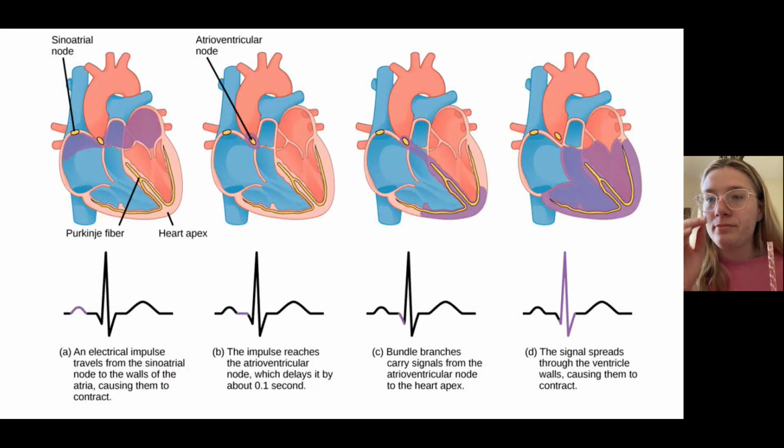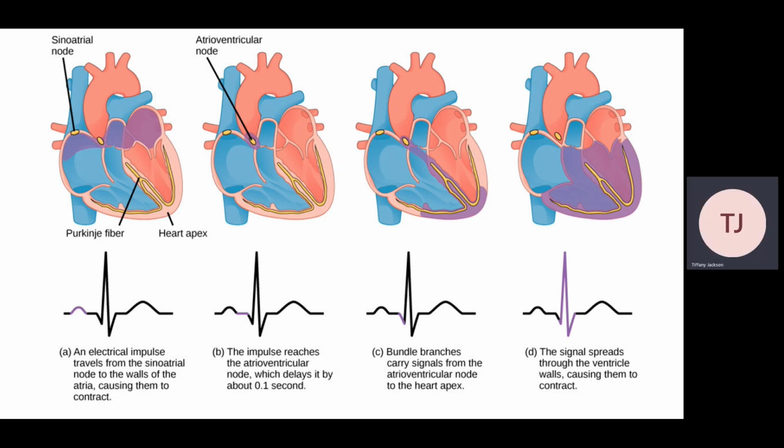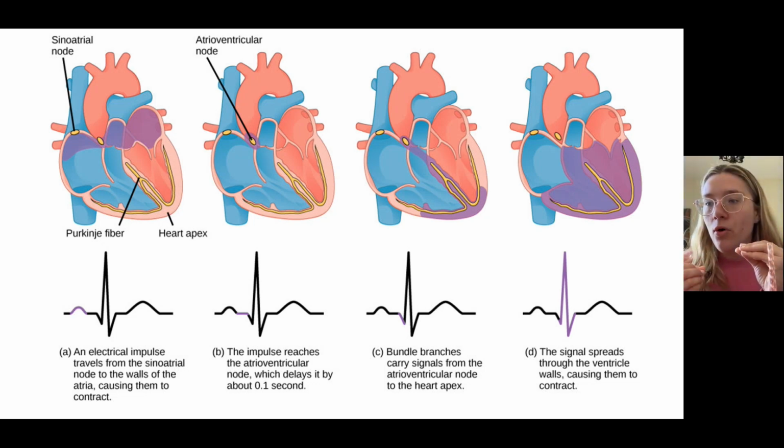And finally, we're going to talk about heart block. So, again, what's happening here in the heart? Well, we talked a lot about our electrical activity. So remember, our P wave is our atria squeezing into the ventricles. After all that blood squeezed into the ventricles, my ventricles are full. So what happens when my ventricles are full? Well, then they squeeze out to the body. So it's kind of in a uniform pattern: squeeze, fill, squeeze, squeeze, fill, squeeze, squeeze, fill.